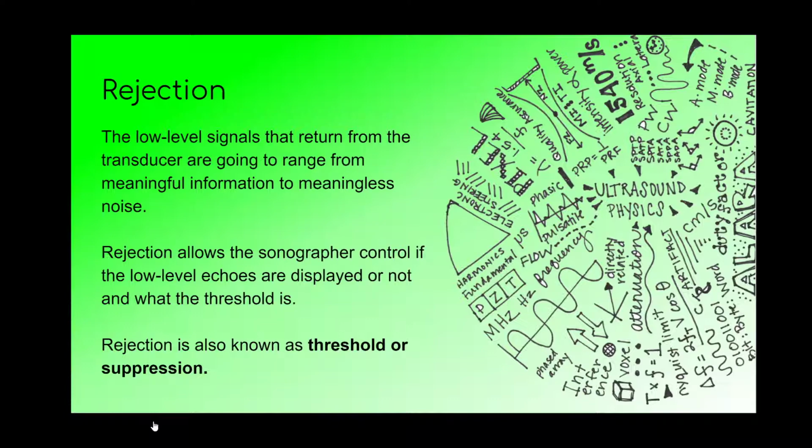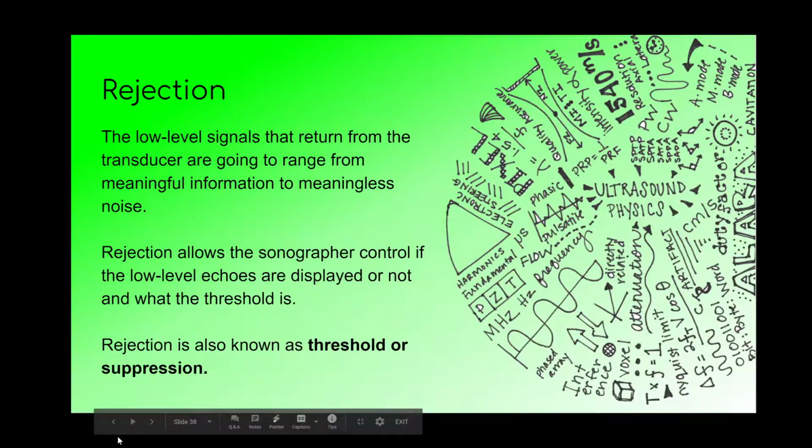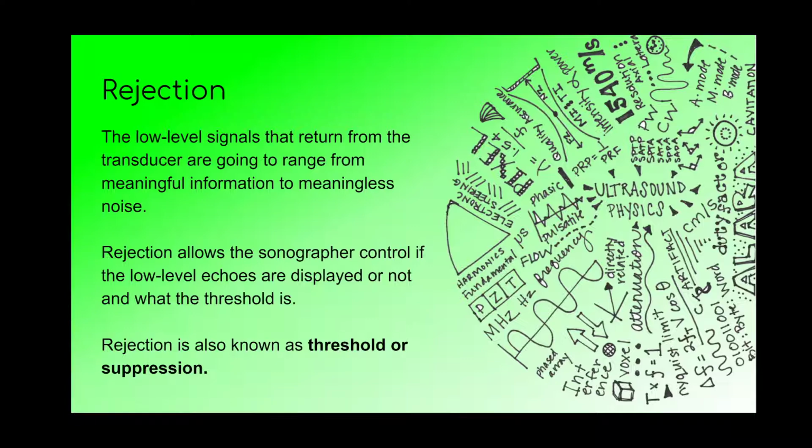As a sonographer, you have the option to increase the rejection or change the threshold or suppression. So 2 names for rejection, threshold or suppression. And you can tell the machine, all those little low-level grays, I don't want them anymore, get rid of them, make them the same as anechoic.